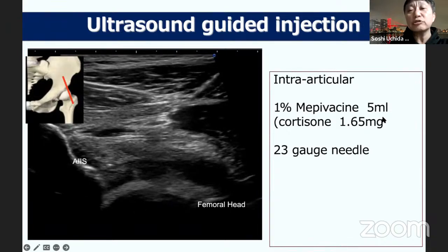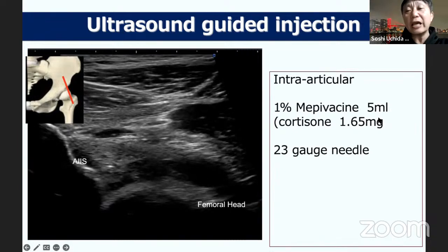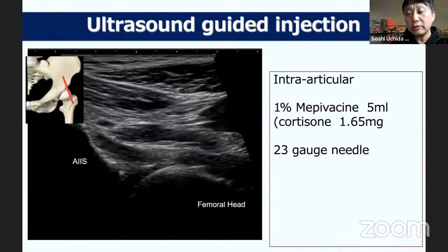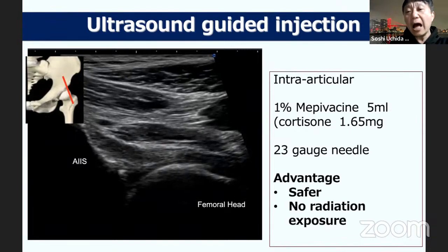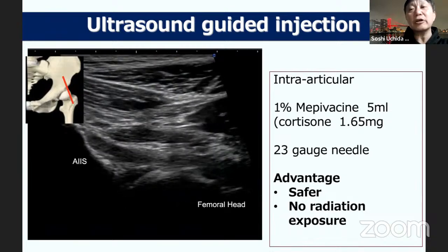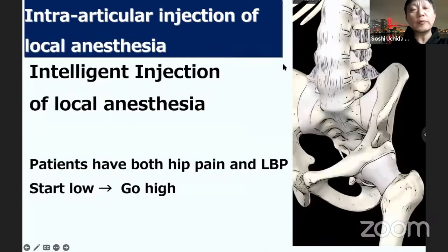We usually utilize a 23 gauge needle. This procedure has the advantage of being safer, with no radiation exposure compared to fluoroscopic injection.